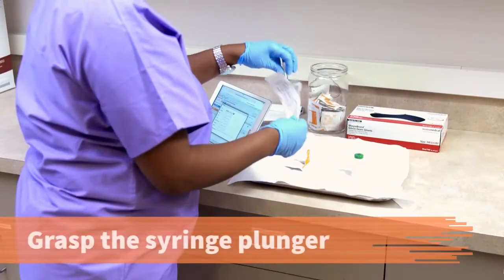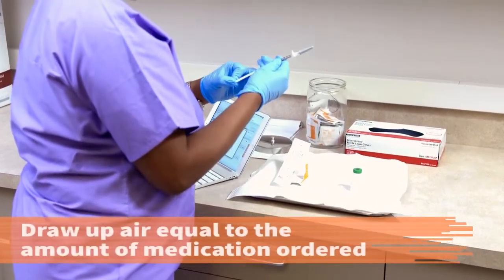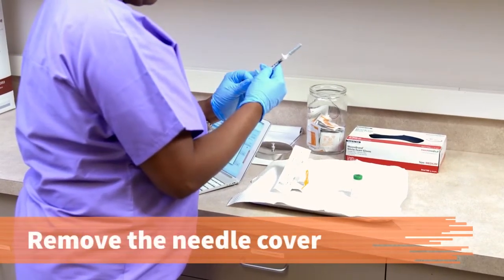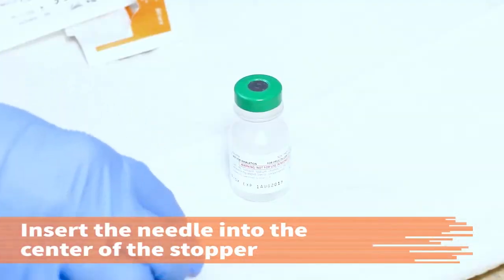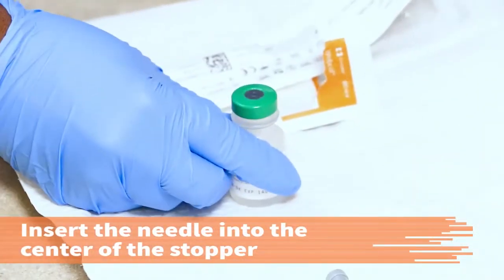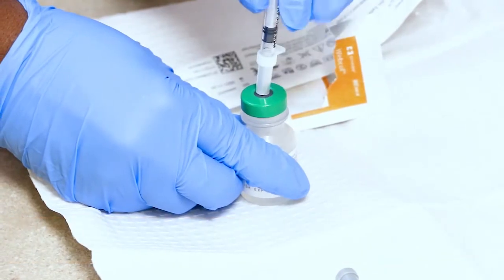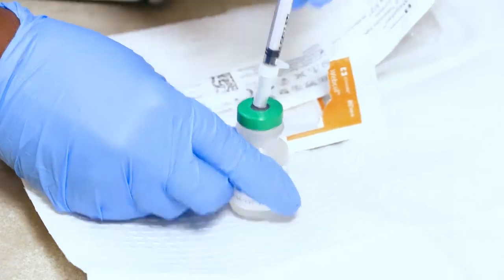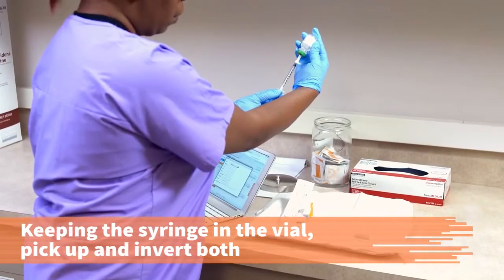With the needle cover in place, grasp the syringe plunger and draw up an amount of air equal to the amount of medication ordered. Remove the needle cover. Hold the vial firmly against a flat surface and insert the needle into the center of the rubber stopper. Careful that the needle touches only the cleaned rubber area. Inject the aspirated air in the syringe into the vial. Keeping the syringe unit in the vial, pick up and invert them.